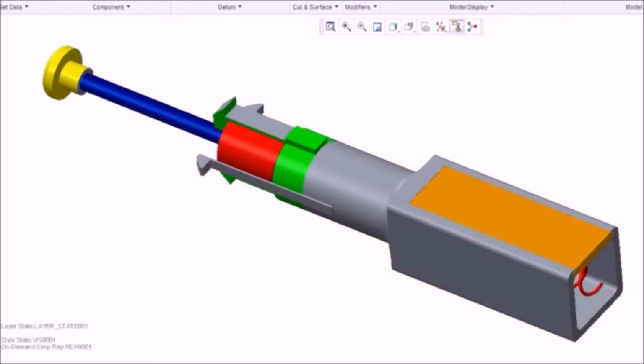The housing is attached by 4 fasteners, allowing customization in the hemostat used and replacement of the films or the cartridge itself throughout the procedure. Despite the progress that we made on our device, there are still refinements that we'd like to make. Adding features such as a counter to the handle would add functionality and usability to our device.